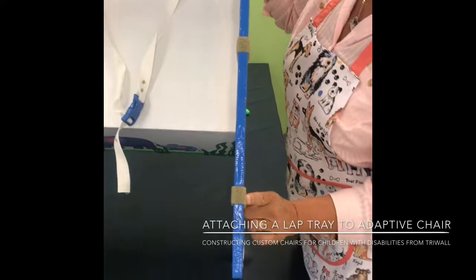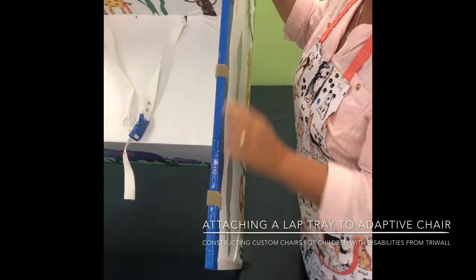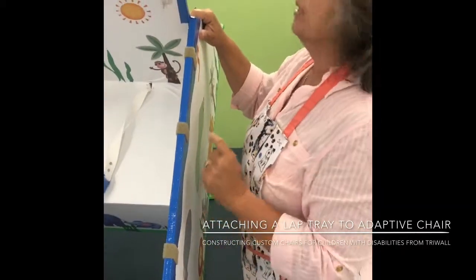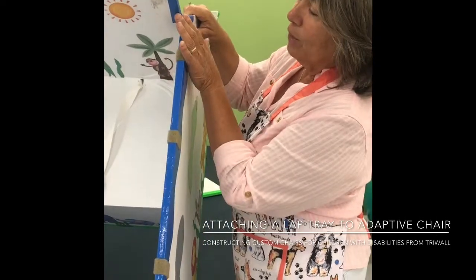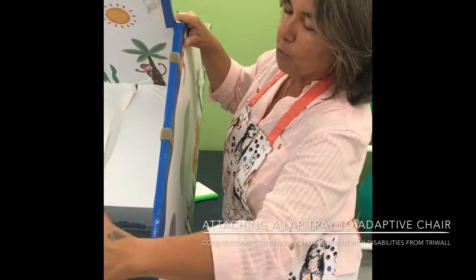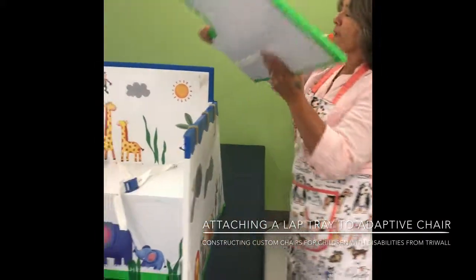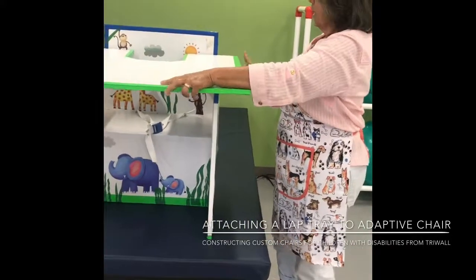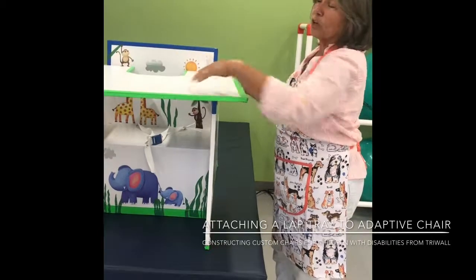You're going to wrap that loop around. This is sticky-backed loop velcro applied in several places — we have it in three places to make it nice and secure. It's more important to have them back here because if you have weight on the lap tray, the lever arm is going to be more forceful in the back.